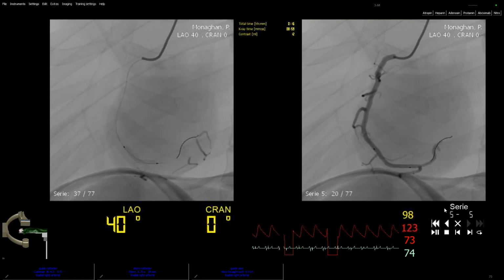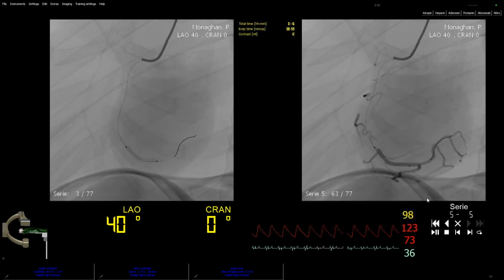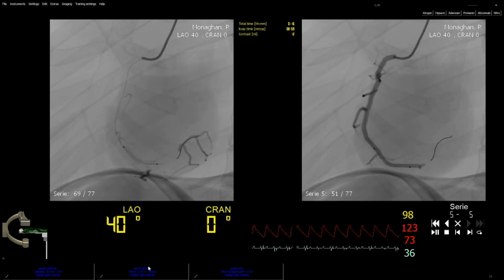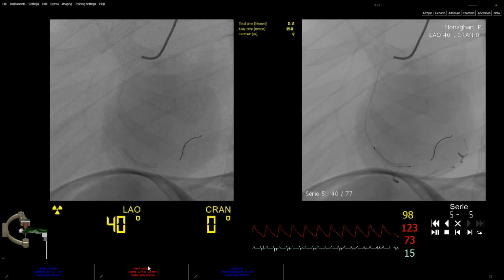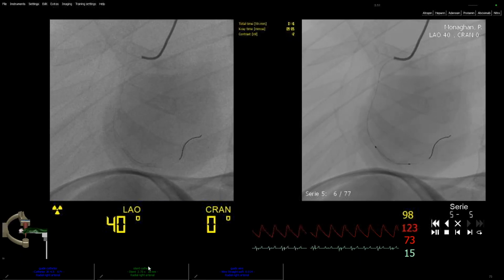You can differentiate between the old image and the new one, and you can see the arteries, see how it is. Yes. And now, Ahmed, you did the cine loop again, also on the right side now. So anything else, Ahmed, or that's it?